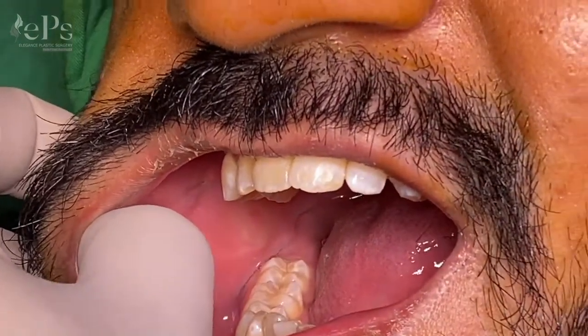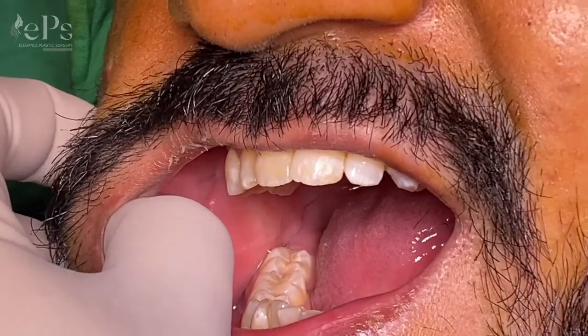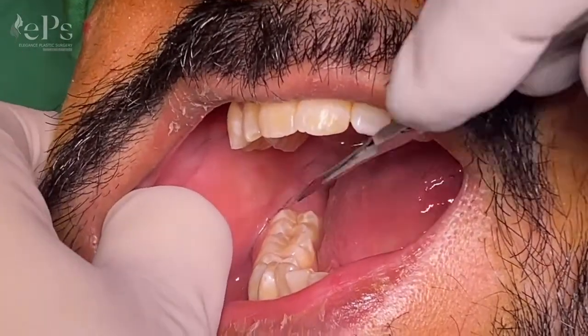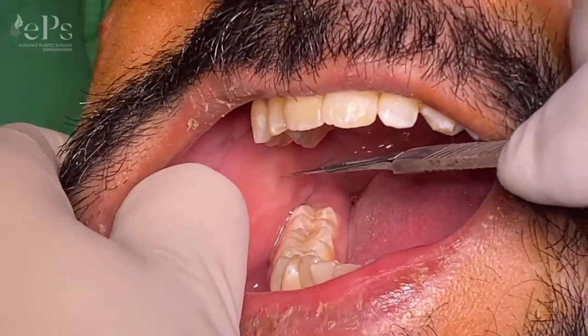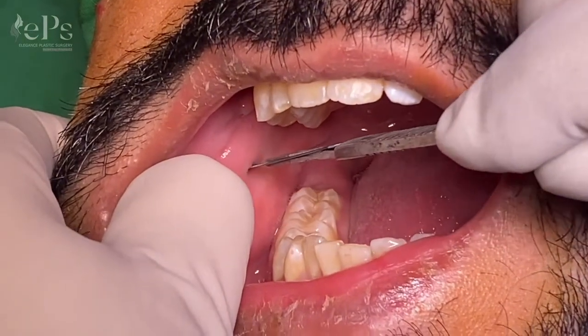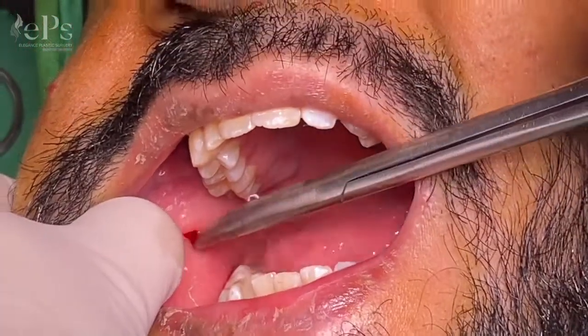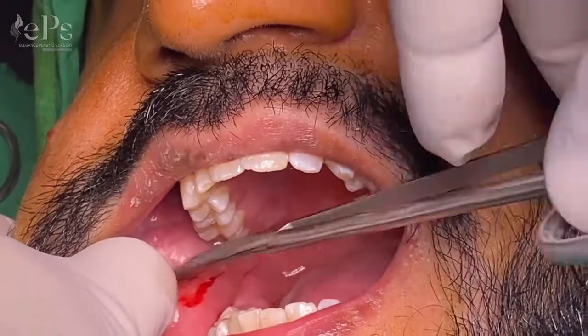For the incision, the ideal blade is number 11. You need to support it from the back and then give the incision. You can use an artery or scissors and just dissect.